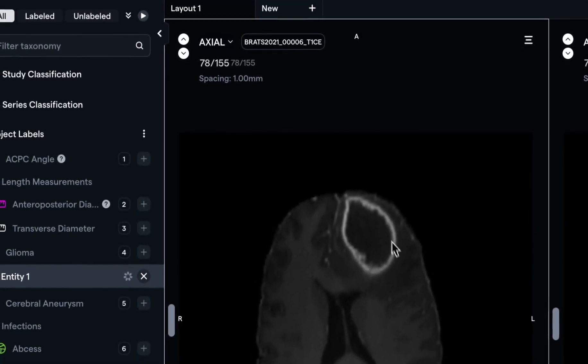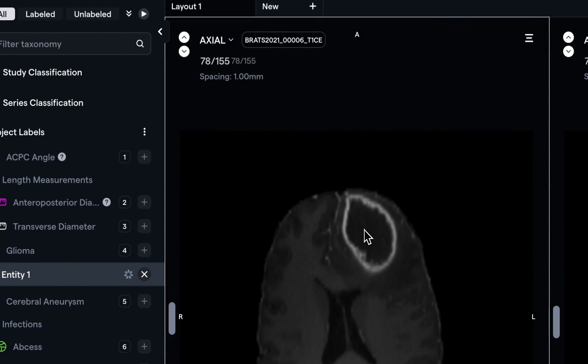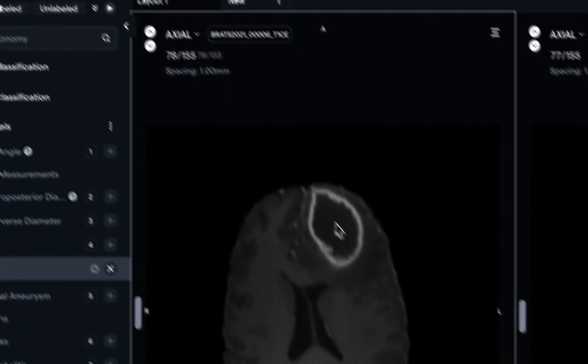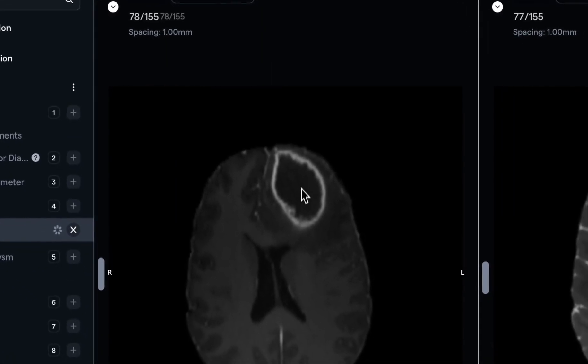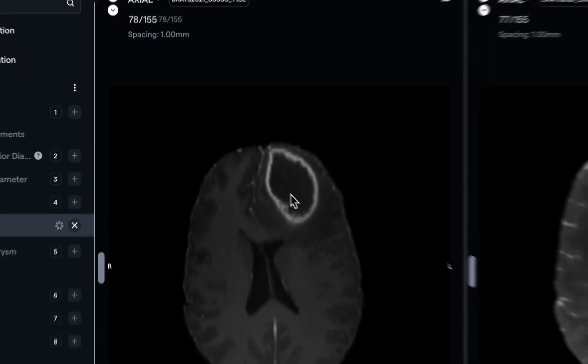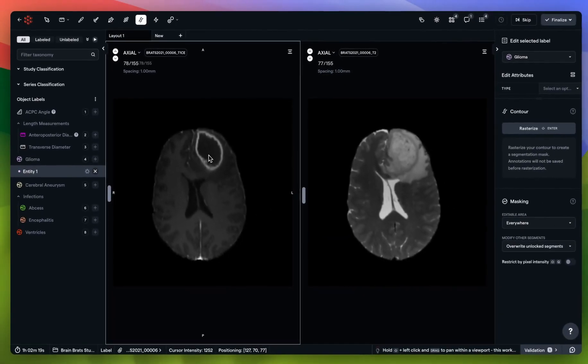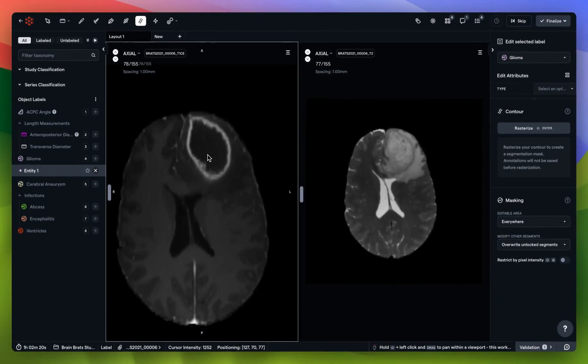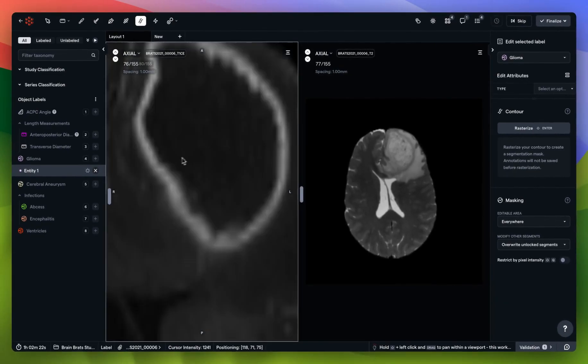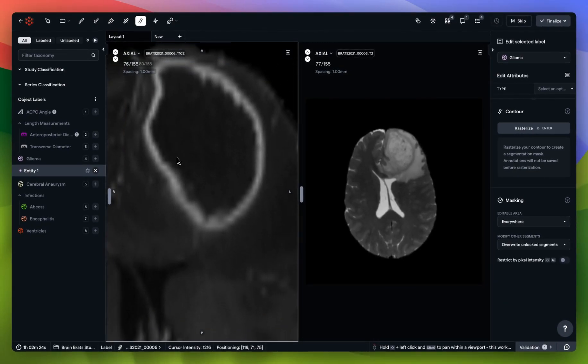I'm going to choose a glioma contour tool and let's say that I want to do this structure here on my T1 contrast enhanced scan. I'm going to hold ctrl and scroll.